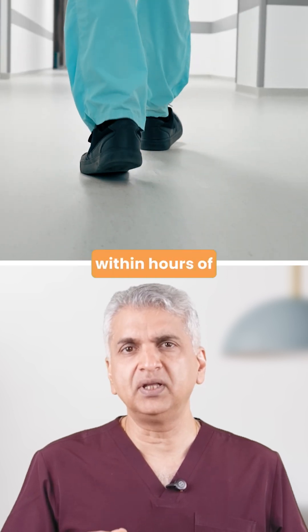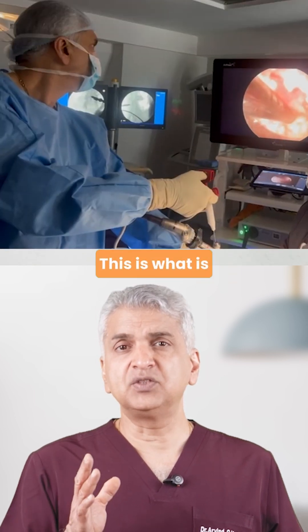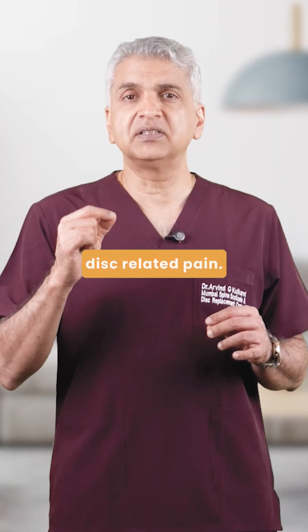Patients often walk within hours of surgery, and most go home the same day or the next day. This is what is called state-of-the-art surgery, not just in India, but anywhere in the world. And it's changing the way we treat disc-related pain.